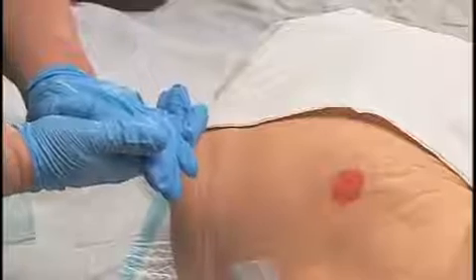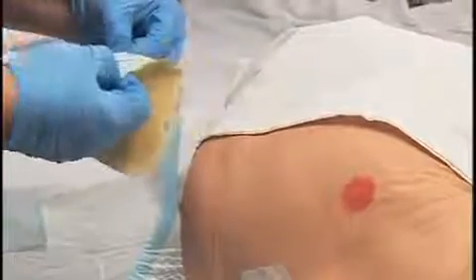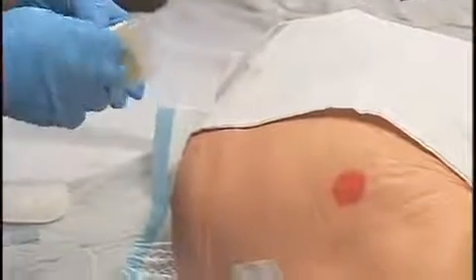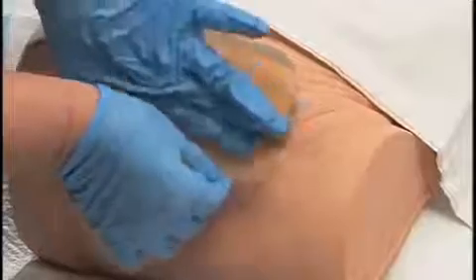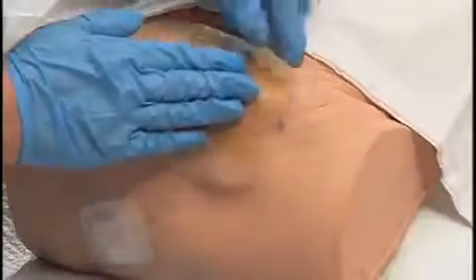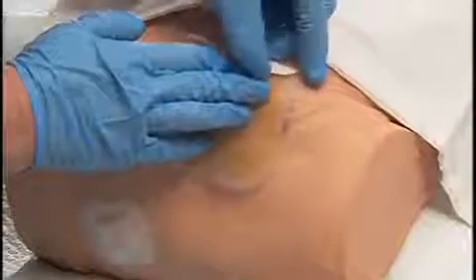Warm the hydrocolloid by holding it between your hands, as this will help increase adhesive ability. Remove the paper backing from the hydrocolloid, gently fold it in half lengthwise, and apply from the center of the wound outward. Smooth the dressing in place from center outward, then hold the dressing in place for a few seconds to improve adhesion.